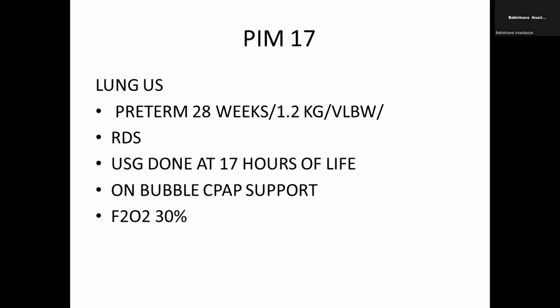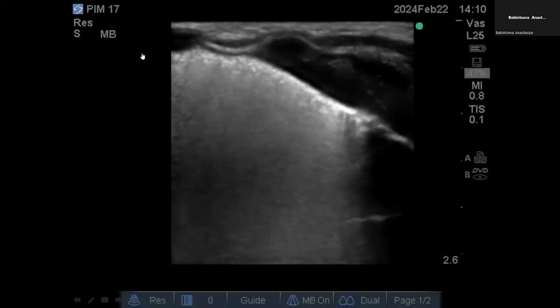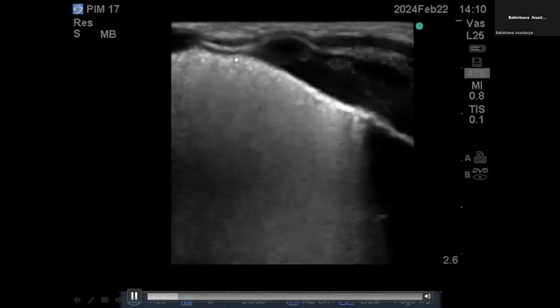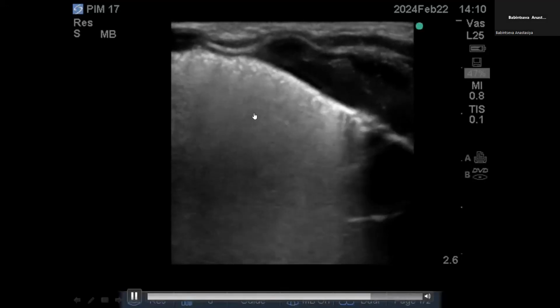Yeah, so this baby was born last night, and baby had distress, so we had put the baby on CPAP, and the oxygen requirement was 30%. Today afternoon, the baby was stable with 30% FiO2 on bubble CPAP, but I just wanted to do a lung ultrasound. At 17 hours of life, I did a lung ultrasound. So this is R1, and I somehow couldn't get a proper alignment. I don't know why I was not getting a horizontal pleural line. Pleural sliding is there, but the pleural line looks continuous yet irregular, or maybe because of the subpleural consolidations, I'm able to see it like that. And there's a white out lung.